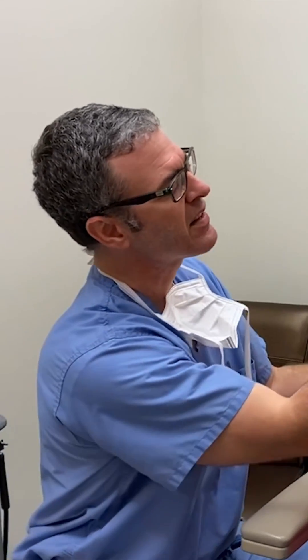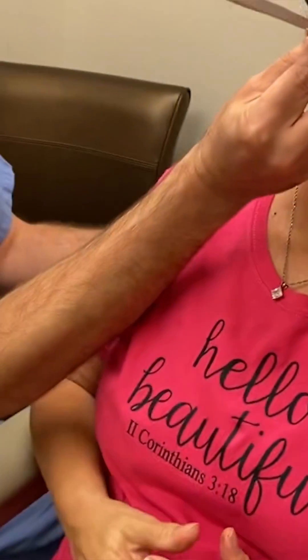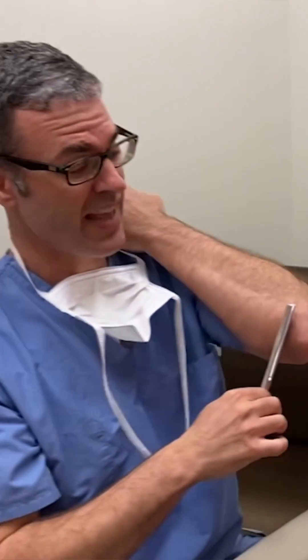So we're going to do the Weber test first — show me your teeth. And what side does that go to? The right. So that confirms that.